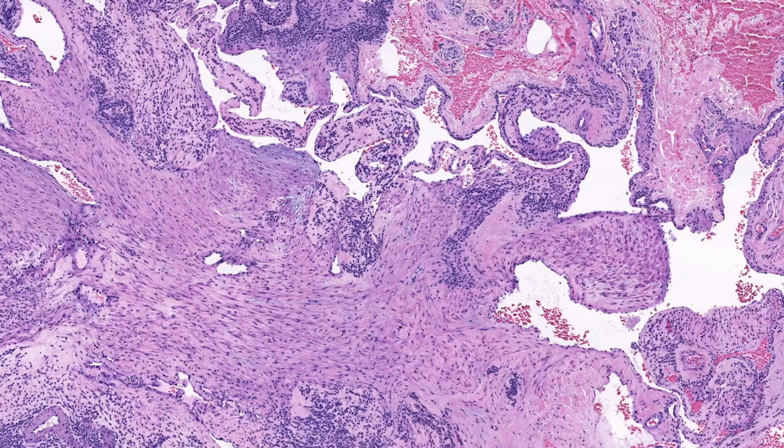Last but not least, rare atypical or malignant examples have been described. Features to look out for include nuclear atypia, increased mitotic activity, and atypical mitotic figures. Cases with only nuclear atypia are designated as symplastic glomus tumor and have the same prognosis as a conventional benign glomus tumor.